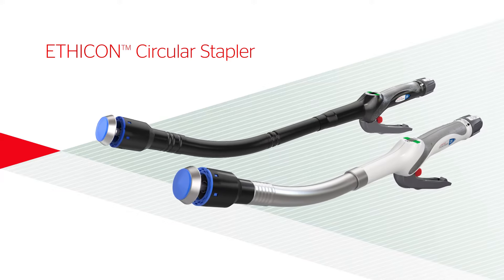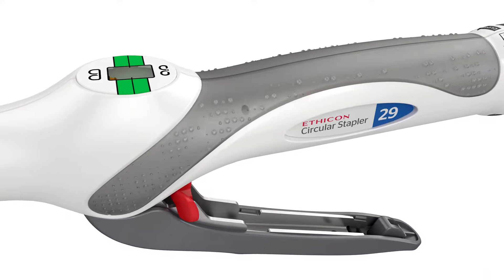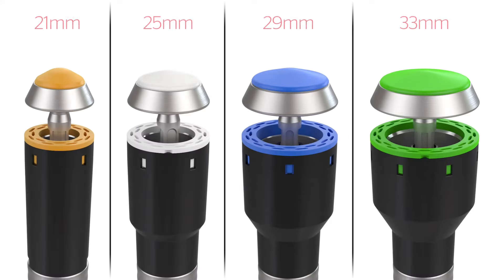Ethicon Circular Stapler. The Ethicon Circular Stapler is used throughout the alimentary tract for end-to-end, end-to-side, and side-to-side anastomosis. It is available in four sizes for proper matching to the diameter of the lumen.